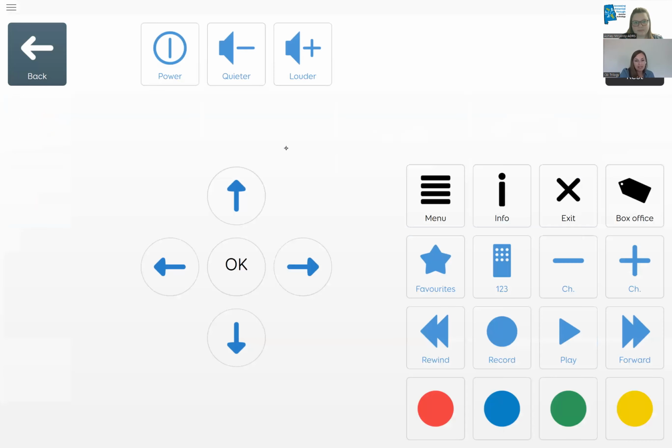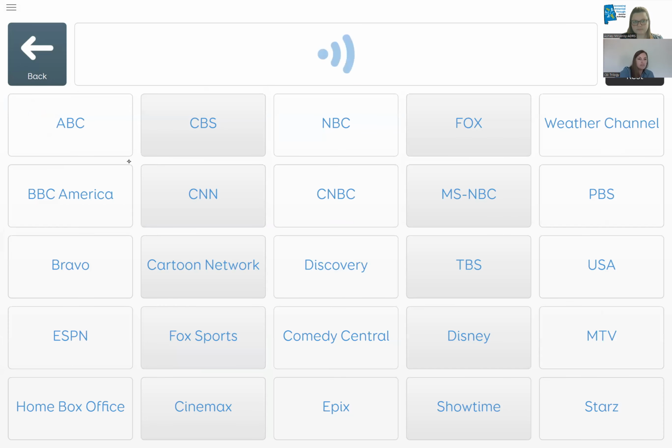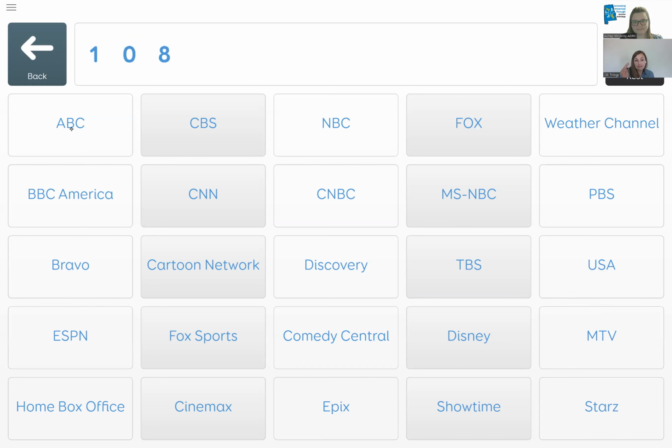Ashley and I have discussed this, I kind of like the set top box because it has more things already set up. Then you're just programming it from your remote. My favorite part of the set top box is this favorites. They have it set up where it's already programmed for each of these providers, but you can go in and edit all of these. So if I wanted to tune ABC, instead of having to push 108 and activate all of those separately, it's going to go ahead and send that infrared signal to the television and then change the channel to that.